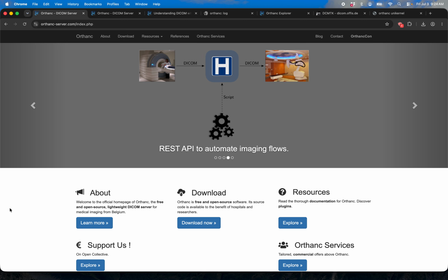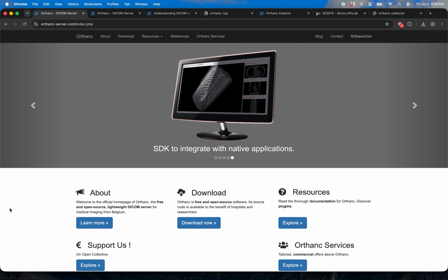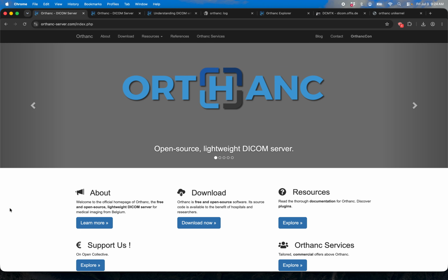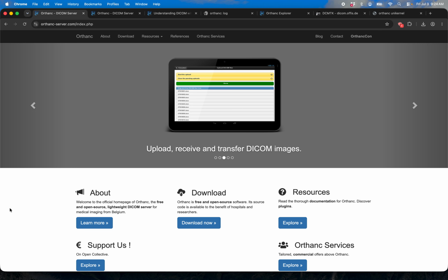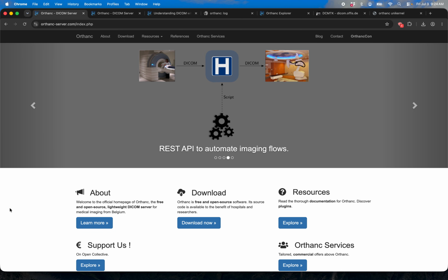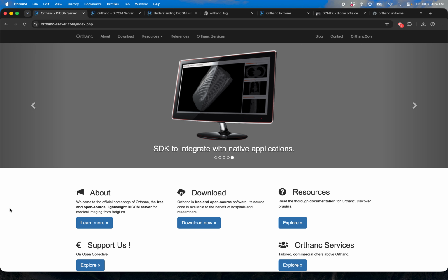And of course, they don't just take like one image; they take a set of images. One day they come back the next week, take another set of images, and then it's both a file format and it's also kind of a network protocol as well. And the reasoning behind it is because these images, they're not just images, they have a metadata layer to it, so describing a lot of data about the patient in general.